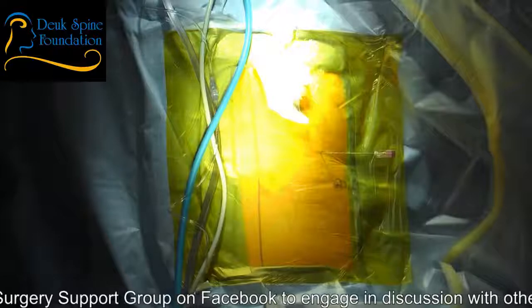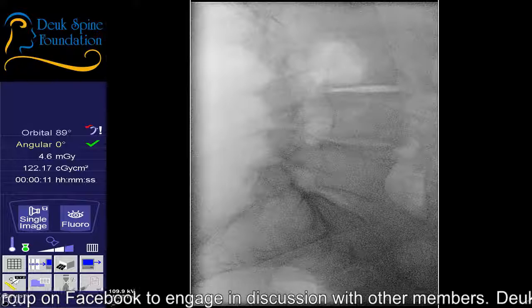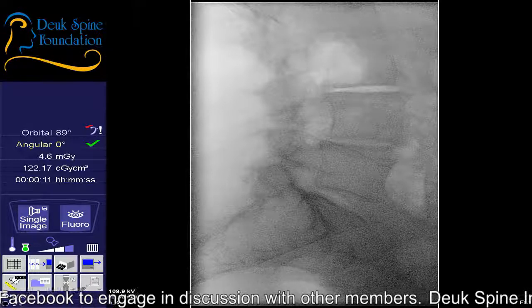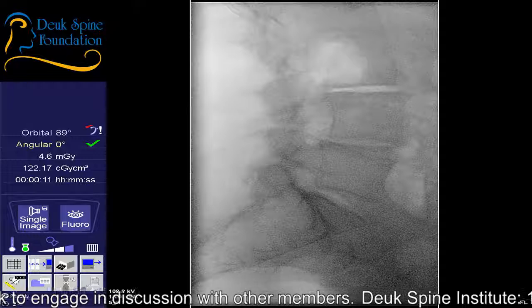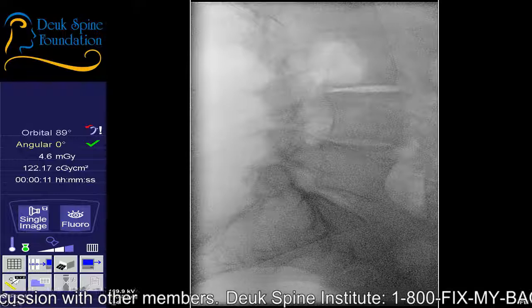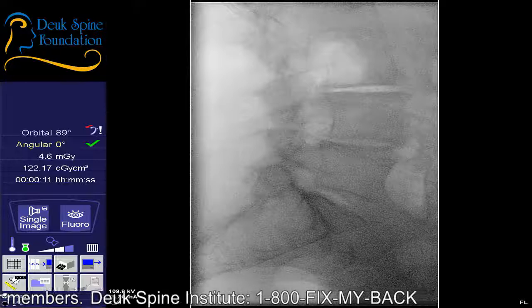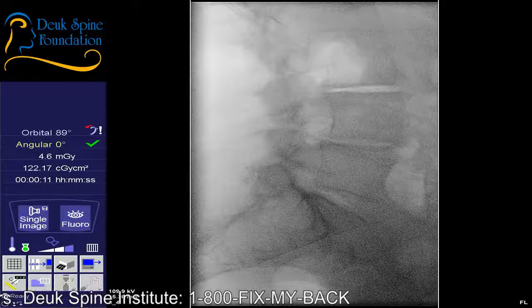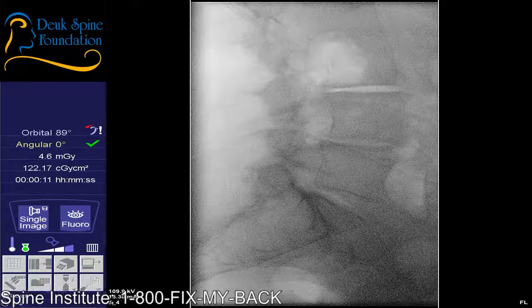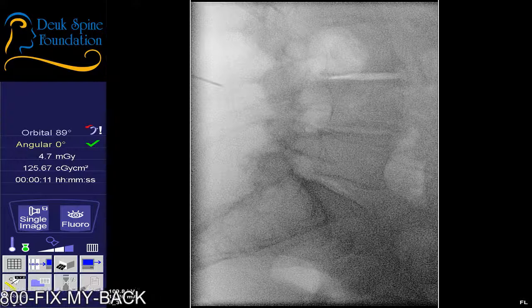Shot. We've talked before about x-ray images. So, Jordan, we're focused on L4-5 first. You can see there's a little anterolisthesis at L4-5. That's our first target. So I think you're pretty good. I think we could see a double shadow of the pedicle just a little bit. So maybe you can do a little wagging. Shot. All right. It's not too bad. Still a double shadow on the pedicle. Maybe we can try a different wag.